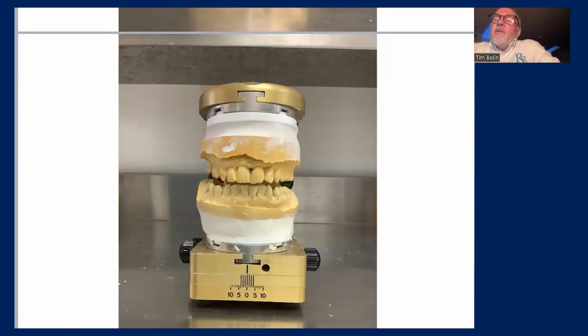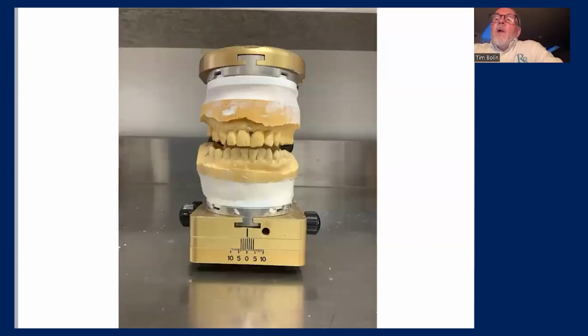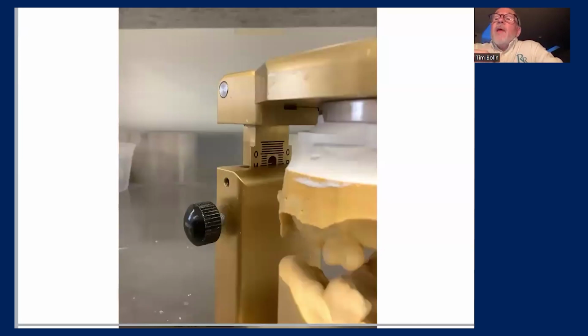I think if we were to fabricate right here, we'd have a real issue. So we're going to use a mathematical formula. Now we need to open it up 5 millimeters. So that's that MP position, which shows where we opened it up to get our clearance in the anterior of the case. So we've got the 5 millimeter vertical opening established.